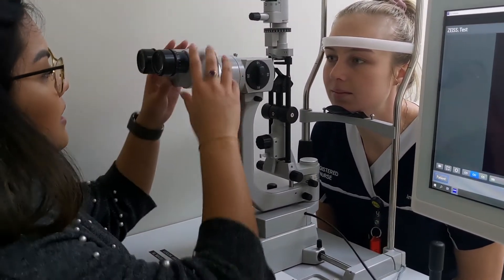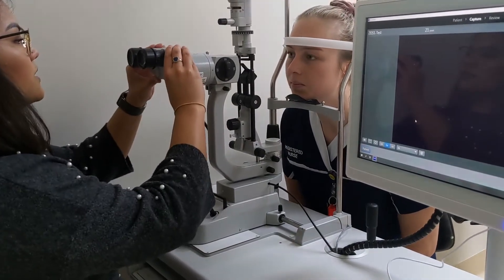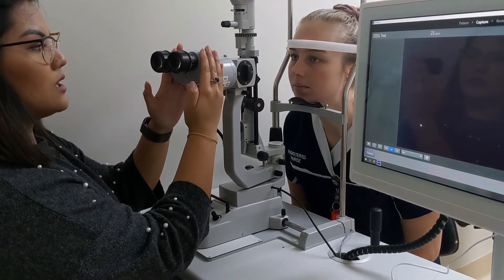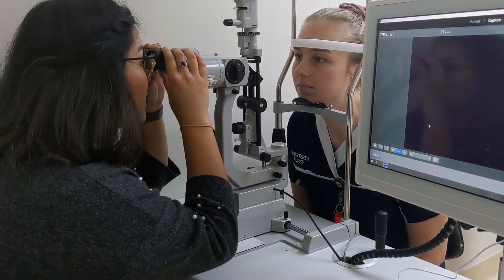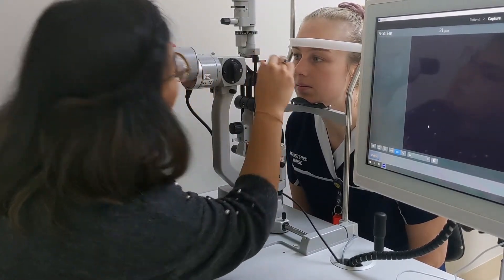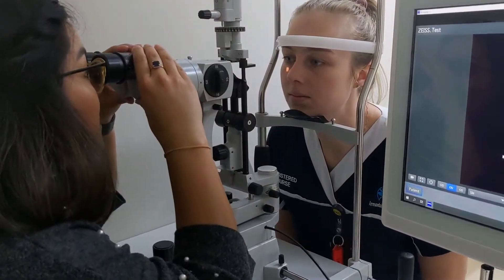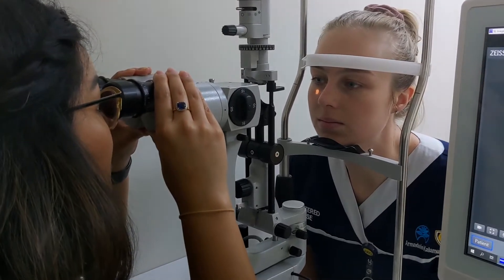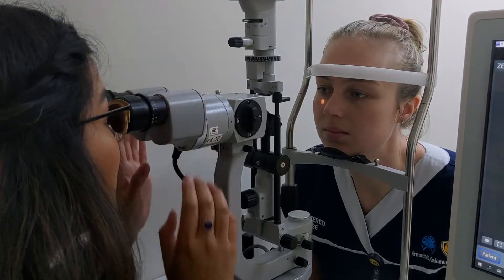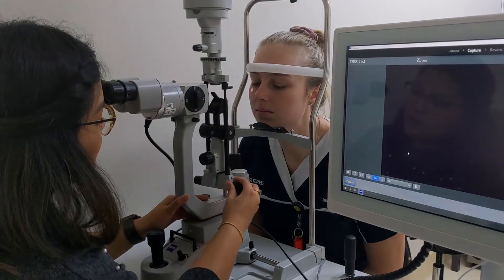In terms of positioning yourself, you start with your slit binoculars as close as possible, then look in — I've got glasses so I'll pull them out — and adjust the interpupillary distance accordingly. You want this to be straight, and this is the arm you'll be moving around.